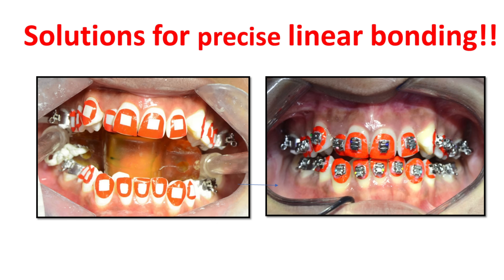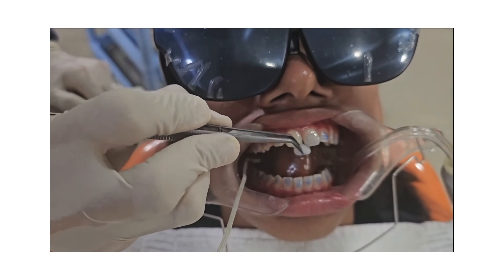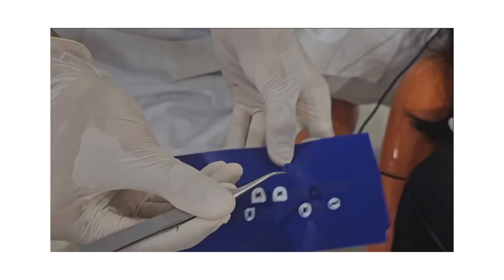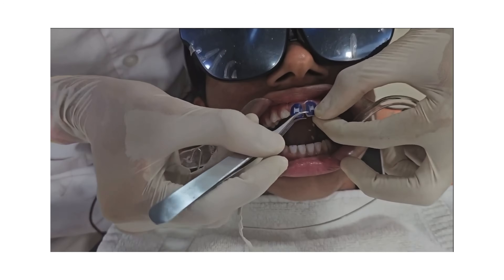Available for BATR brackets as well as for conventional brackets. This is a demonstration of how to use the Step Up stencils. Etch the tooth, then peel off the sticker from the sheet and apply on the tooth such that the occlusal edges and long axes match.